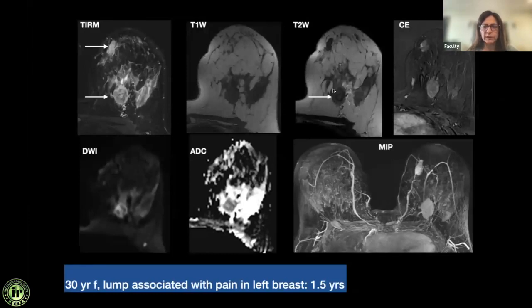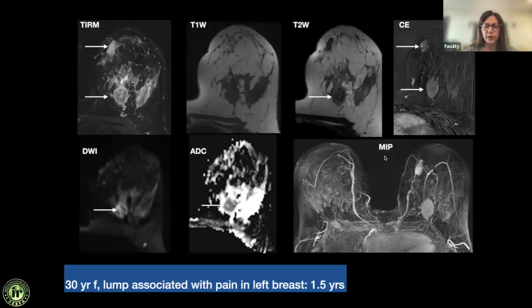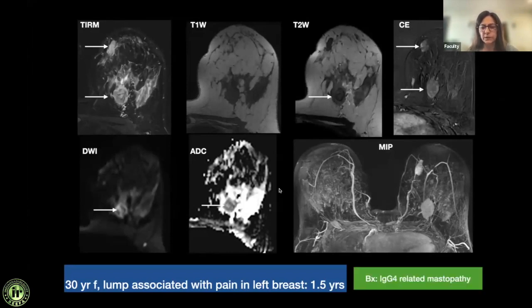Case 13: A T2-dark lesion mimicking malignancy — morphologically irregular, very low T2 signal. The enhancement pattern is very homogeneous; combined with restricted diffusion, malignancy was suspected but the picture did not fit. On biopsy this was IgG4-related mastopathy. IgG4 is a systemic disease affecting multiple organs — these lesions can be T2-low on MRI and represent an important mimic of malignancy.